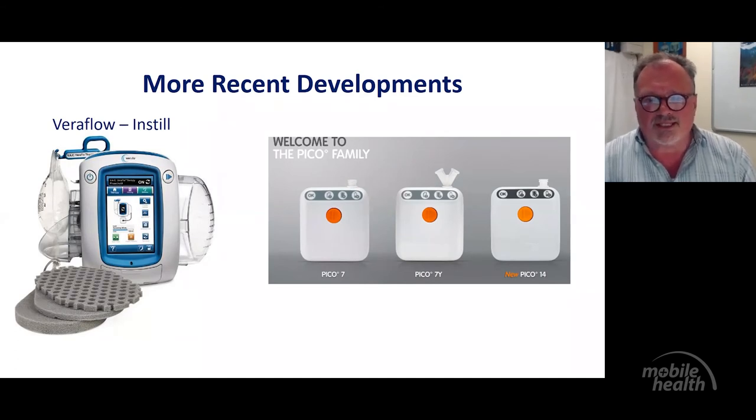With the whole negative pressure system and early discharge, people go to work very early and get the dressing changes done. With those systems, it's similar. There's a second dressing in the pack, which can be changed twice a week if there's a need for that. One which I haven't used, and I just discovered, is the PICO 7Y. I'm not sure if that's on the market in New Zealand, but it shows quite nicely, because we use a Y piece for negative pressure canister wounds, which are two or three different types of wounds.